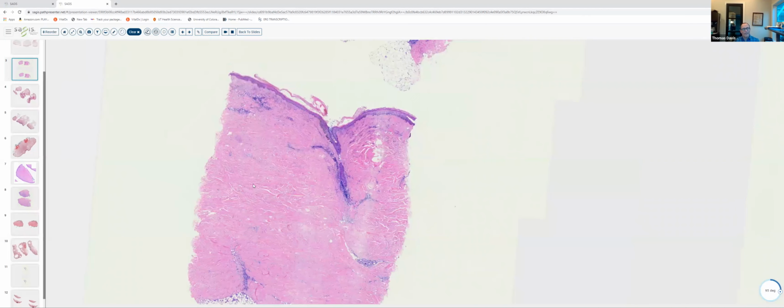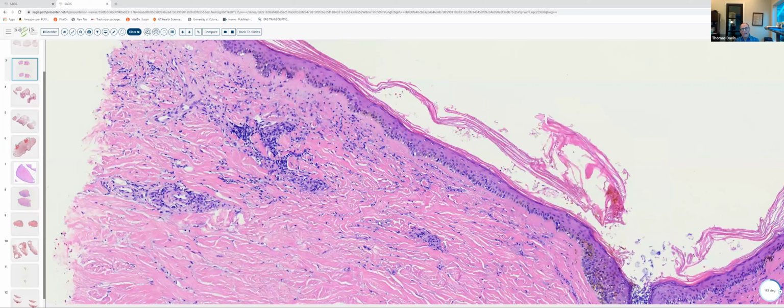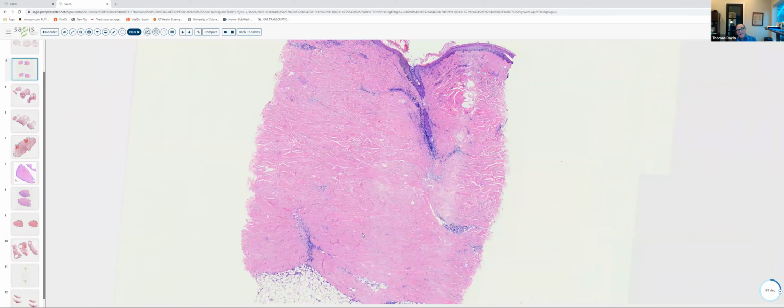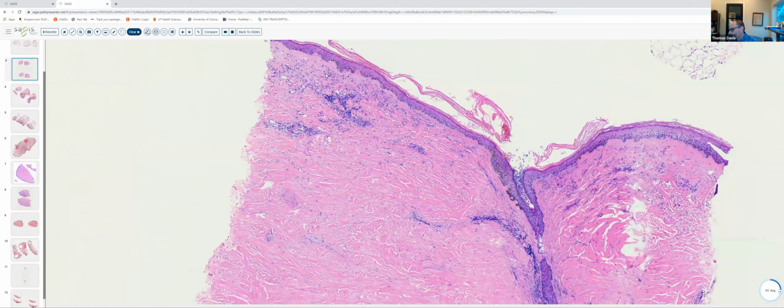We have a similar infiltrate in the upper dermis, but the dermal collagen in the upper reticular and papillary dermis is not quite as sclerotic. You can see spaces between the collagen bundles that you can't in the deeper reticular dermis. And of course, this is morphea, which is our prototypical example of a sclerosing dermatitis in which the sclerosis is present in the deeper reticular dermis. Occasionally, one can see LS-type changes in the papillary dermis overlying morphea, in that the papillary dermis looks very homogenized. But what's different about the LS changes you see in morphea as opposed to LS is that you don't get the band-like infiltrate.